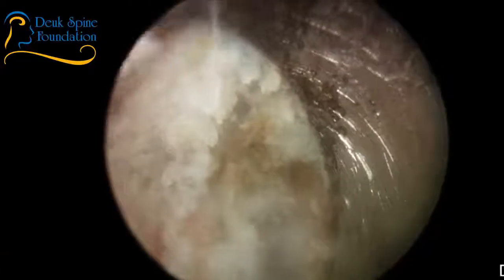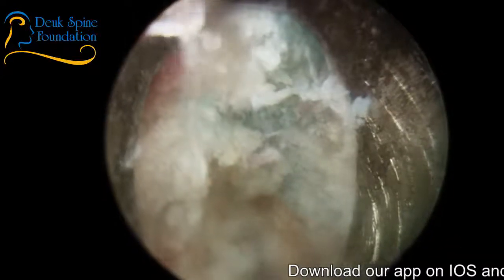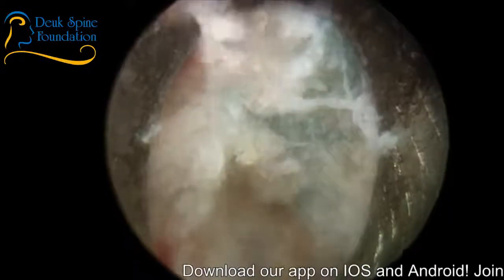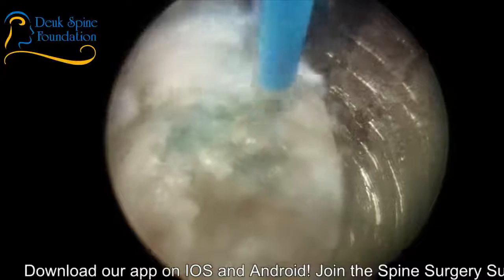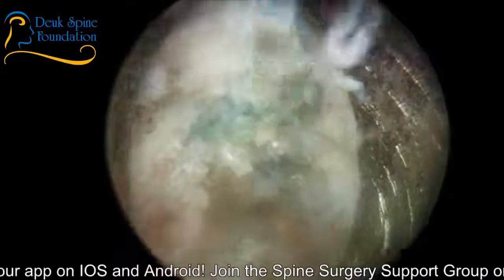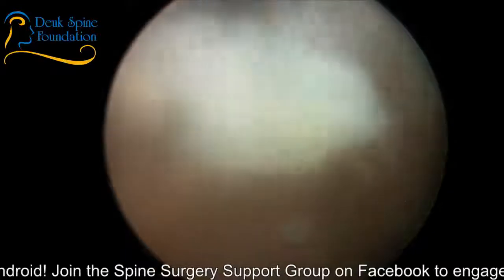All right, so there's the tear, once again, the blue thing, and we're getting our scope and tube in position to get rid of this tear, and the best way to do that is with a laser. The laser I use is a holmium YAG laser. It's a medical laser. It's a $100,000 machine, and it's, in my opinion, the best laser available right now to do this job.